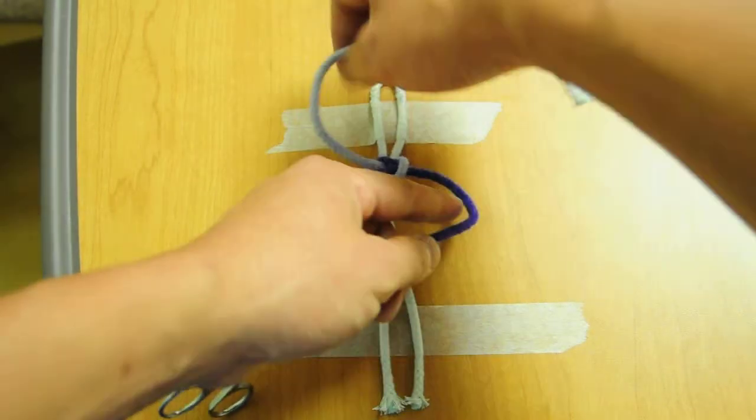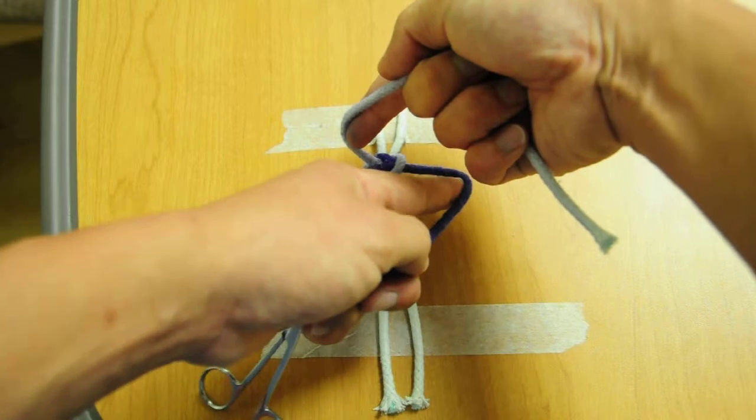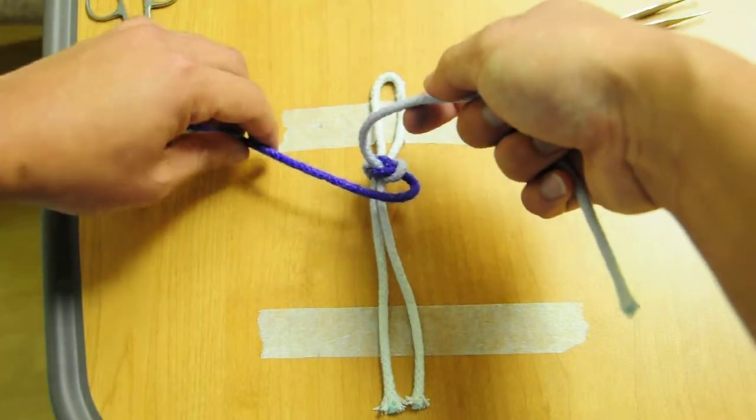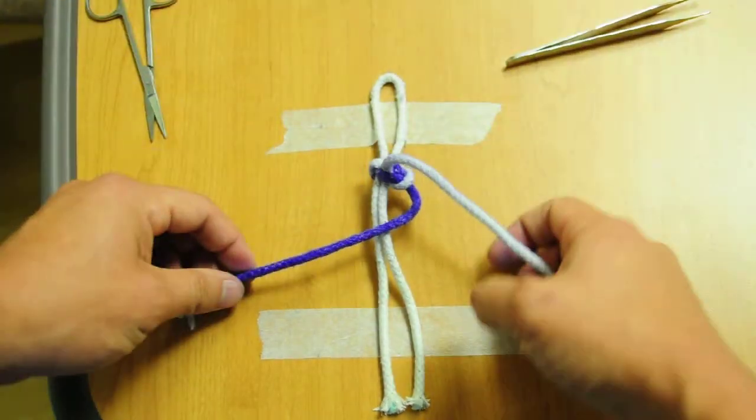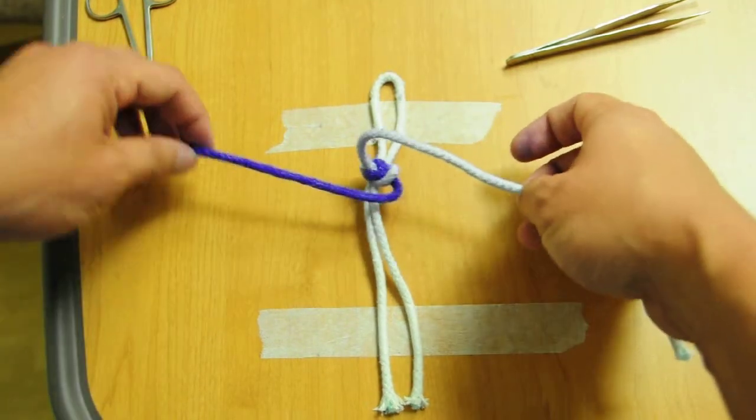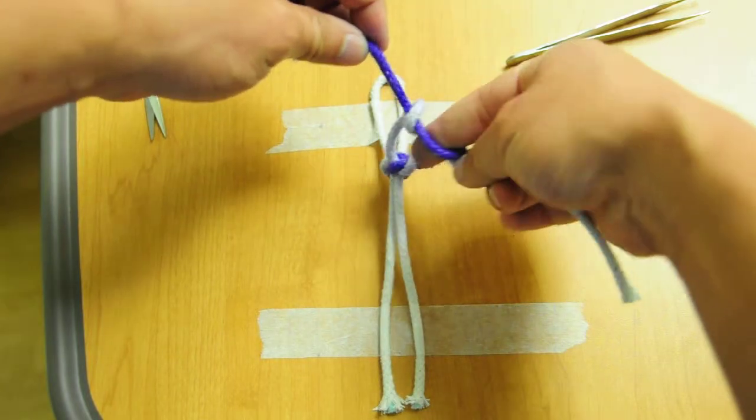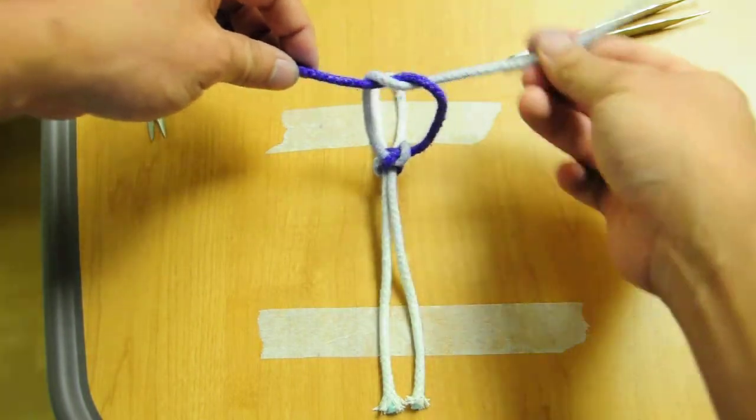Very hard to do, but that's why it's important to get your fingers way down here. Make sure you tie the suture down. So now you're going to go back to your index finger one-handed tie. Hold the suture between your middle finger and thumb. Make the loop over your index finger. Index finger's going to grab it and pull it to the other side. Lay it flat.